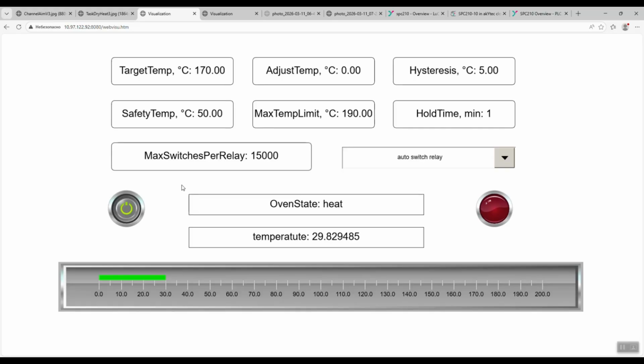When the button is pressed, the sterilizer switches to the air heating phase, up to the required temperature. At the same time, if the safe temperature is exceeded, a warning light will turn on to alert us that there is a risk of burns if you try to take out the instruments right now. When the target temperature is reached, it is maintained for a set period of time.